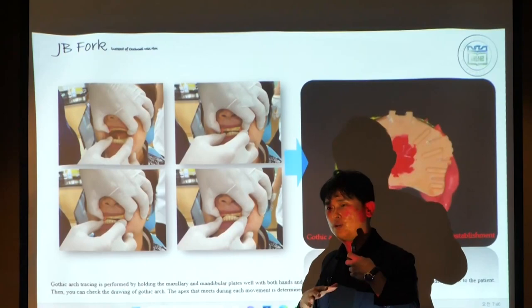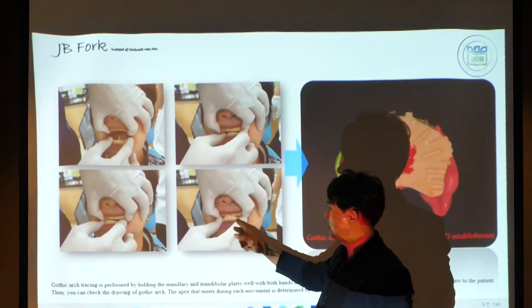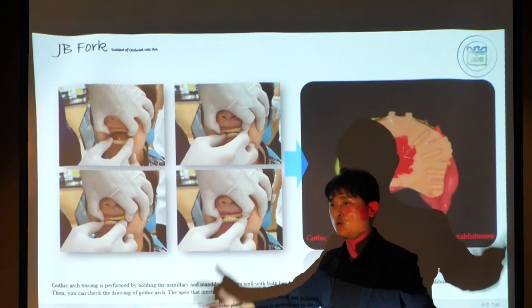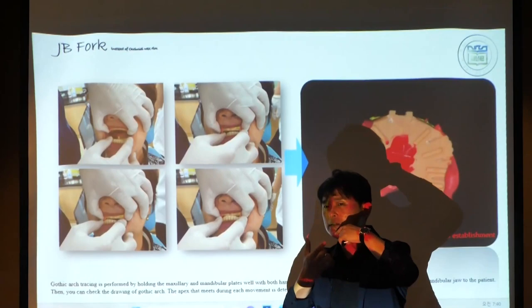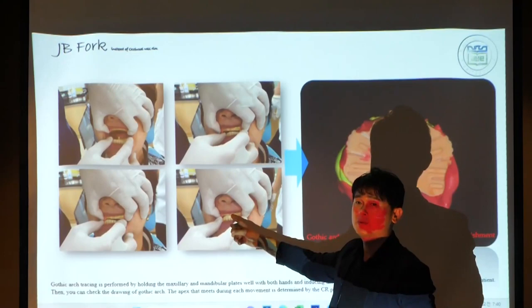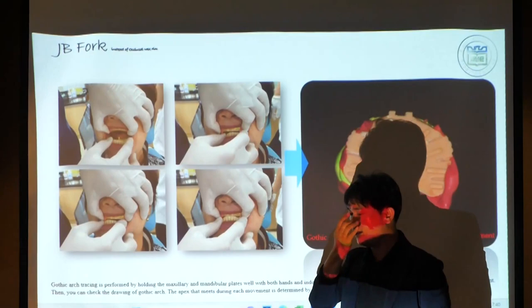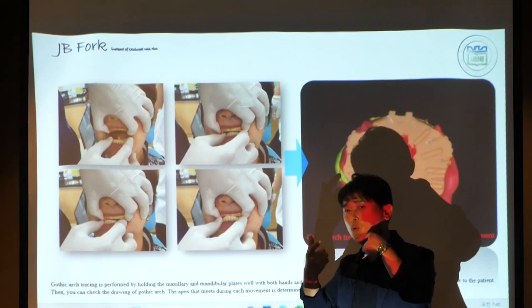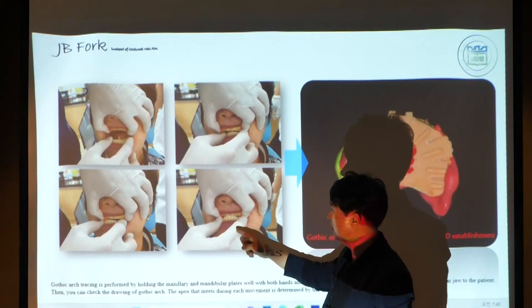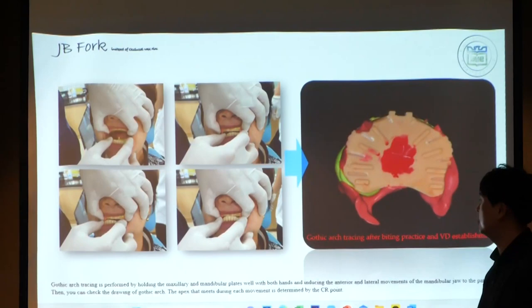Your finger force is only for holding this plate on. You know, your nervous force can impact the drawing, the Gothic arch tracing. Anyway, you have to relax your body at first, okay? And then hold, and then move forward, and then return. Move right side, return. Left side, return. I performed about two or three times. And then this point has to be reproducible. Yes, whenever the patient draws the Gothic arch tracing, every time the patient has to draw the same pattern. It's very important. We have the end of each movement. Anyway, so we can draw like this.